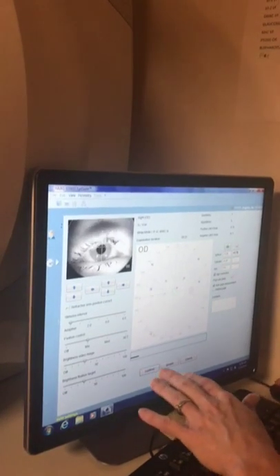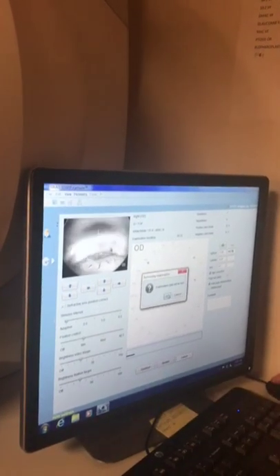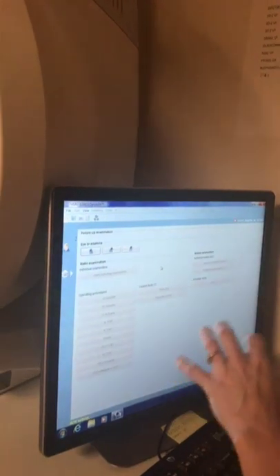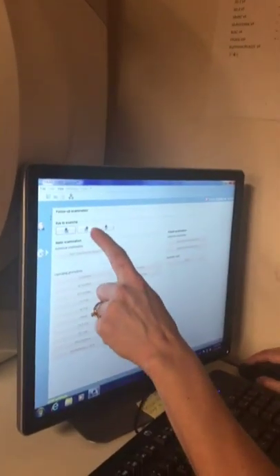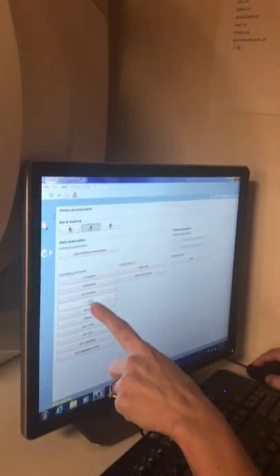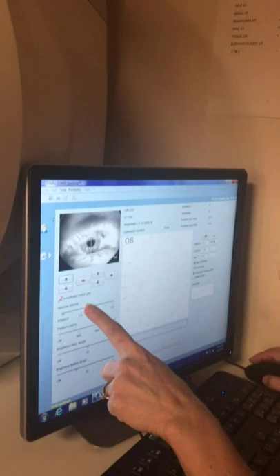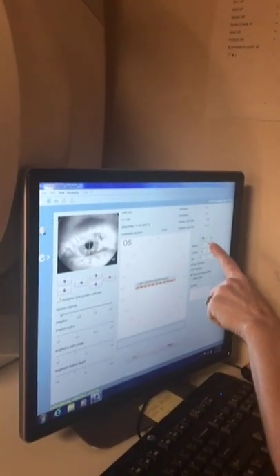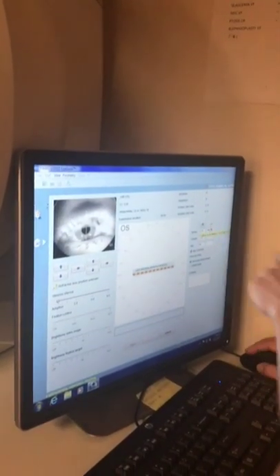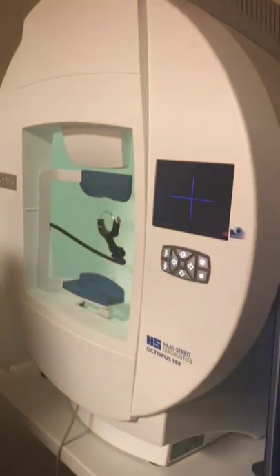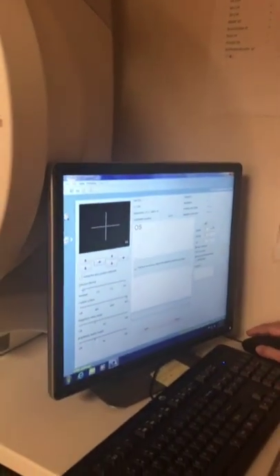Once it finishes, you'll see this screen again. That's whenever you choose left eye, the same test. It'll give you and possibly a new lens if they need a different one. You get the lens from behind you, you put it in the lens holder, and then you just repeat that whole process over again with their chin on the other side.